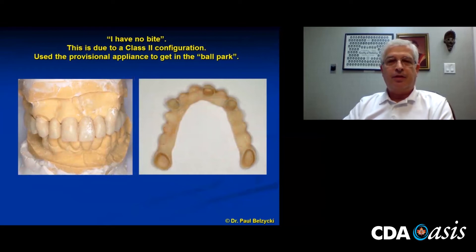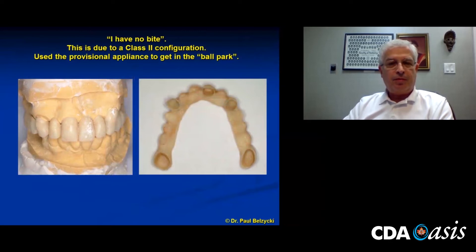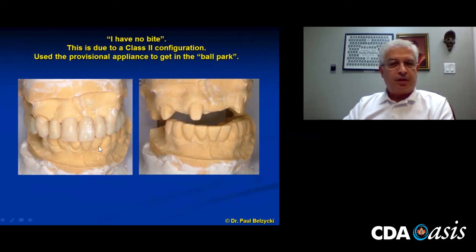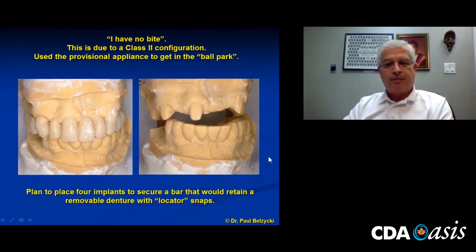I used his provisional appliance to get a ballpark mounting. I took an impression of the copings, put his appliance in place, mounted it, and had at least a starting point. The plan was to place four implants to secure a bar that would retain a removable denture with locator snaps.